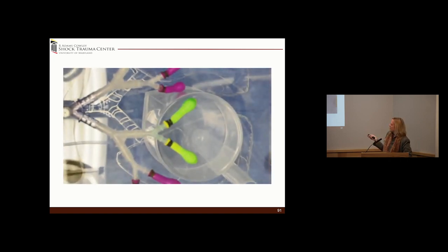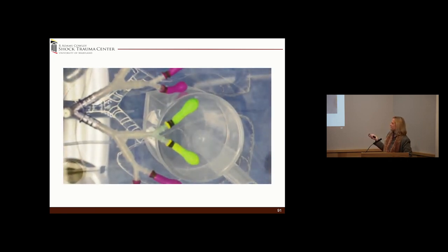So for the same amount of time, within about 3 to 4 breaths, the balloons are empty. Completely empty. Where did it go? Look at the bronchial tree. And this is what happens a lot of times when you switch over to APRV: all of a sudden all these secretions start coming up the endotracheal tube. And that's actually what we looked at.